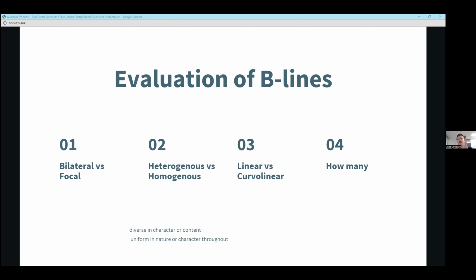But essentially that paints the picture of there's a specific area that is producing a lot of B lines. And then right next to that area, there's a section that's producing no B lines. And that indicates a non-pulmonary edema type of picture, whether it's from ischemia, trauma, infection. But those are just 2 things that you can use to differentiate.